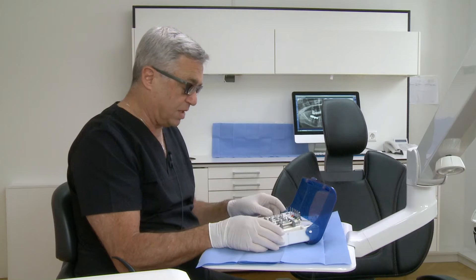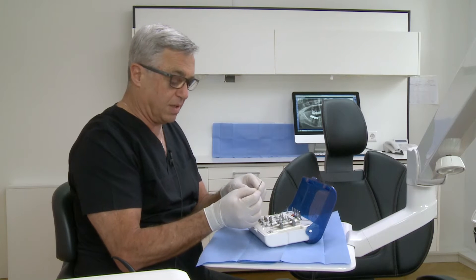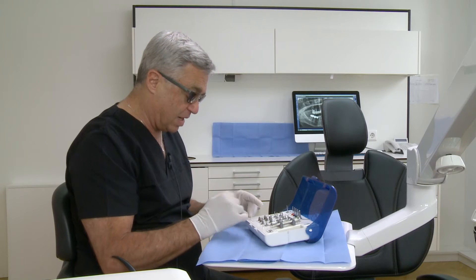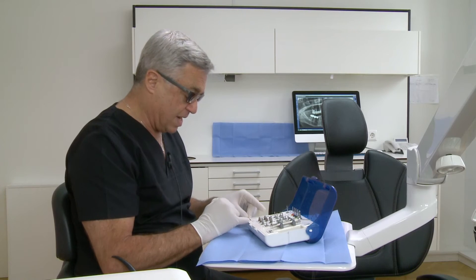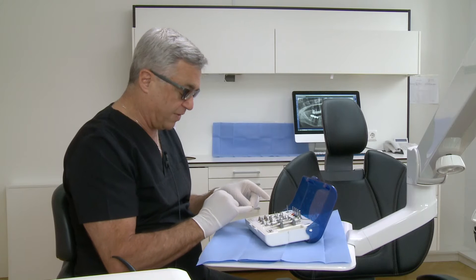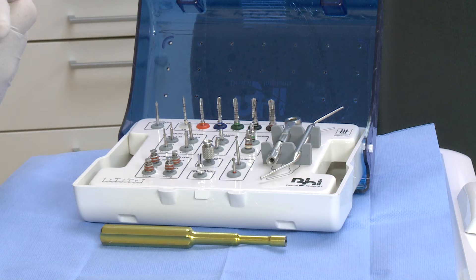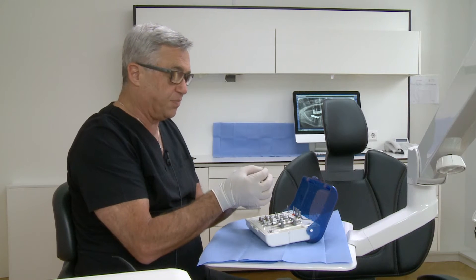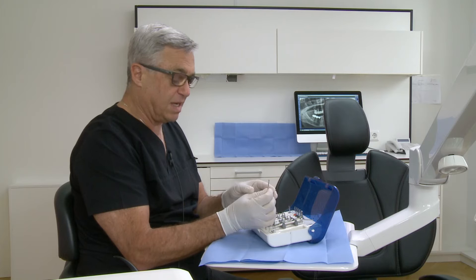After using the marking drills, the first drill from the system is a 2 mm pilot drill. Before we use the pilot drill, it is important to measure the lengths. There are lines on the drill which mark 6, 8, 10, 11.5, 13, and 16 mm. You have in the box a mm mark so you can measure the depth, so you are sure that there are no mistakes. It is a pointed drill and very accurate for the axis and for the depth.